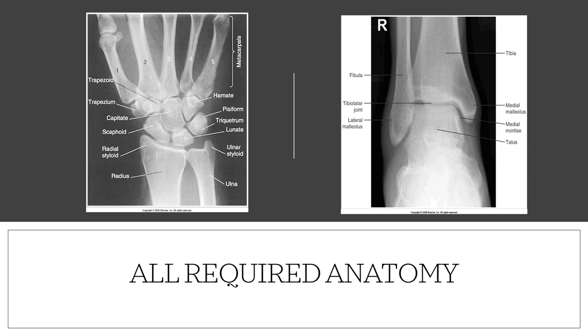Evaluate these two images. The wrist appears to be everything is on with good collimation. Ankle. Unfortunately, I'm not seeing the base of the fifth metatarsal, which is a requirement for this image.